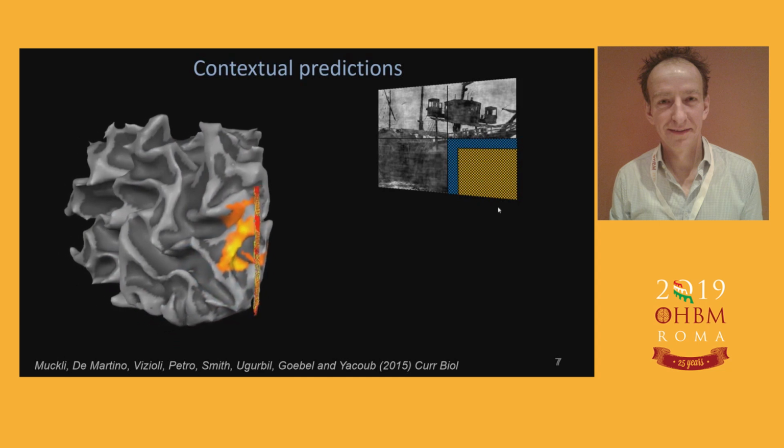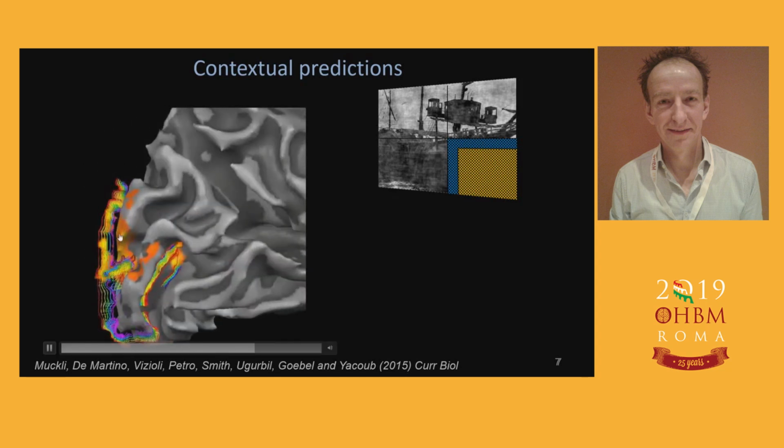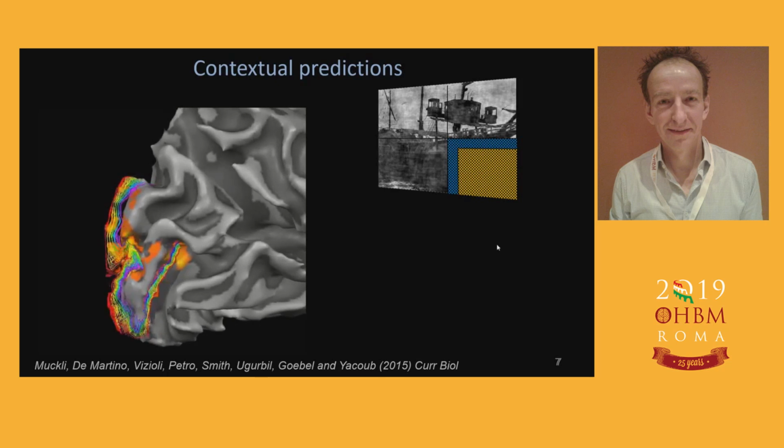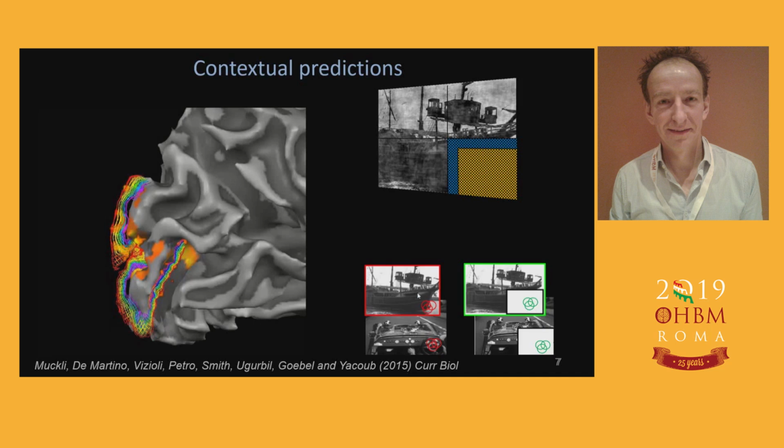Just highlighting, we always do retinotopic mapping. We map out this lower right visual field quadrant in this case, and also the boundary area in blue. Then we sample from these patches in V3, V2, and V1 at 6 different layers, and we assign each voxel to one layer. This is a rough estimate. And then we have different families of voxels of the different depth layers, and we train them with a support vector machine and MVPA analysis to tell us if they have some information about the visual input.